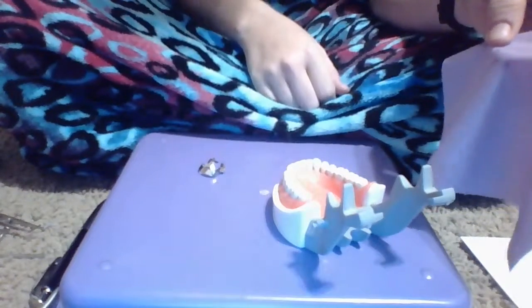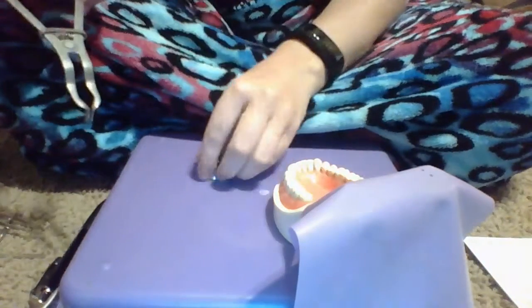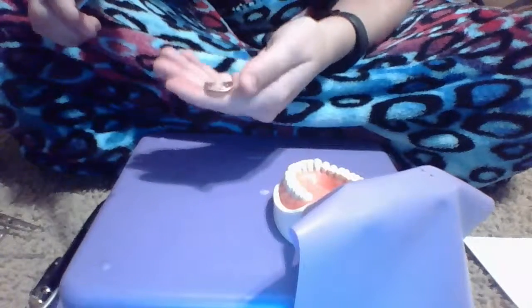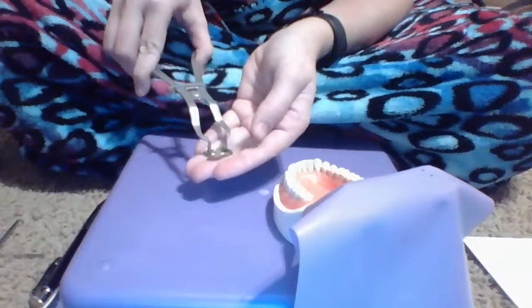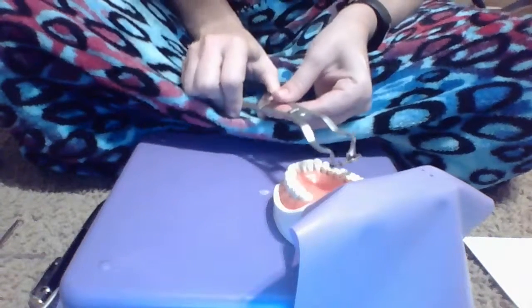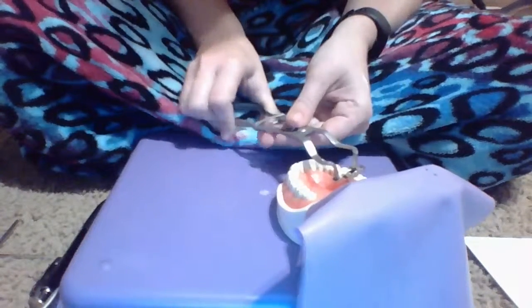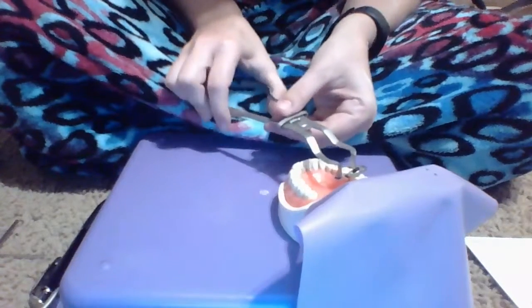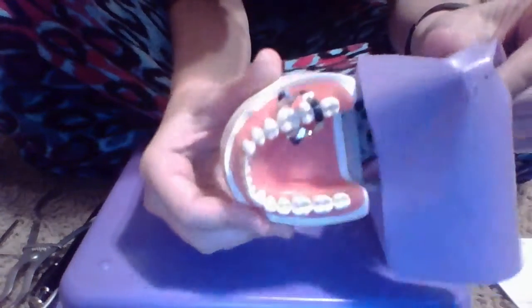Now I'm just going to start putting on my dental dam. I will take my forceps and place them in the clamp in the appropriate holes. I stretch it out so it will fit on tooth number 30, which is your first molar, and get it close to the gingiva without being on top, then release. And that looks pretty good — right on that gingiva.